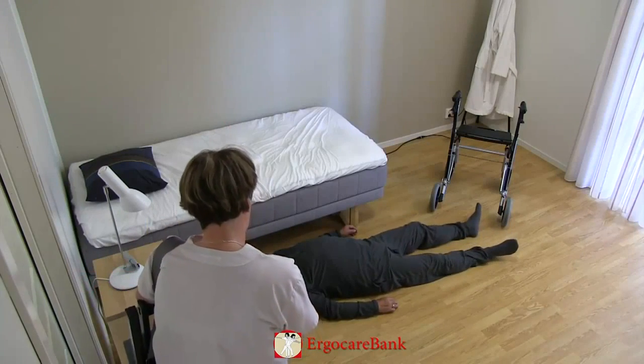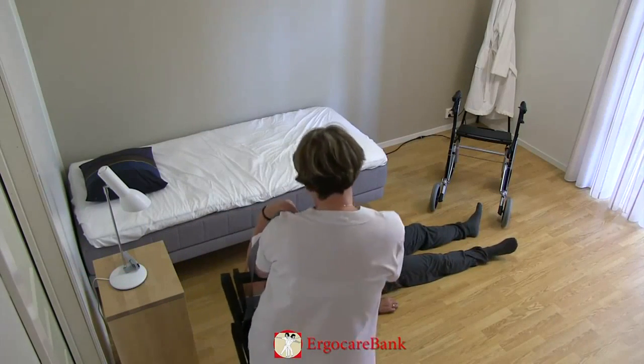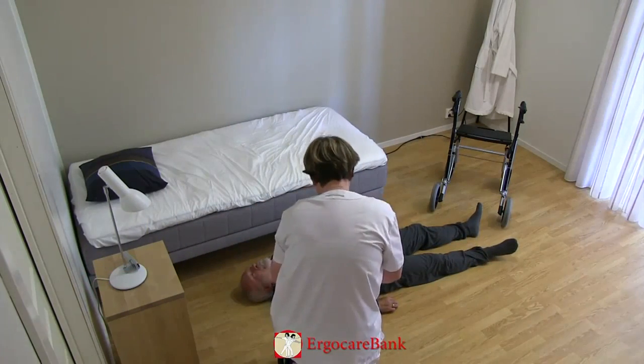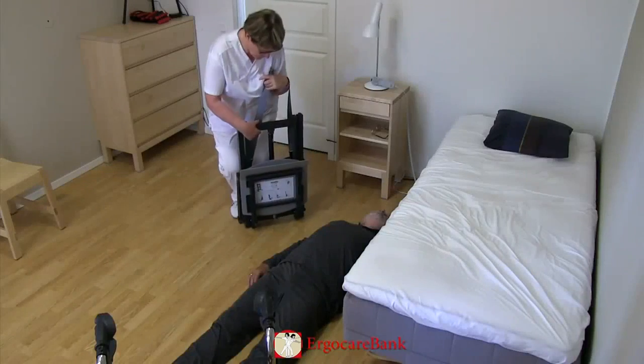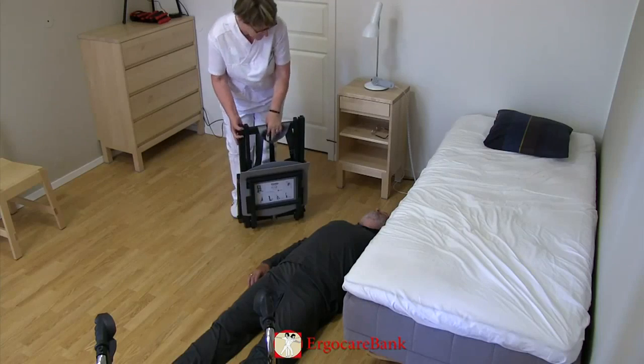Burt has fallen when he was getting out of bed. The staff member has checked that he has not injured himself and decided that he can be aided with the stand-up chair.